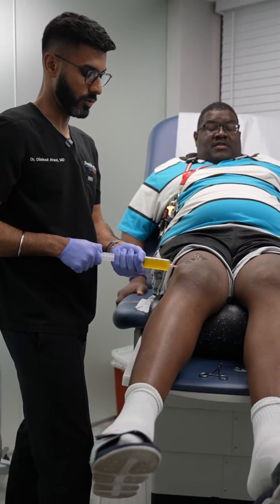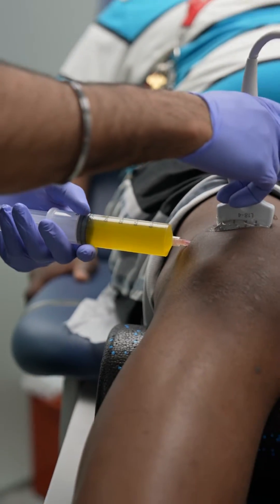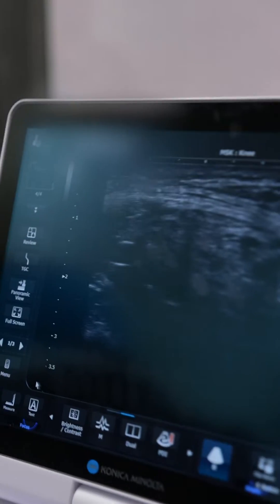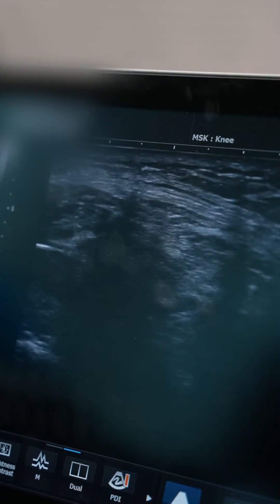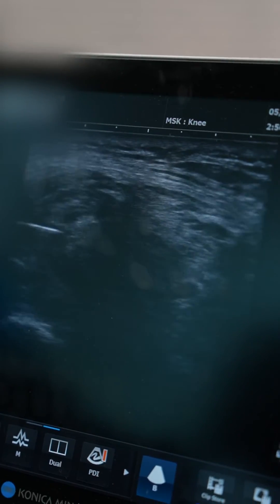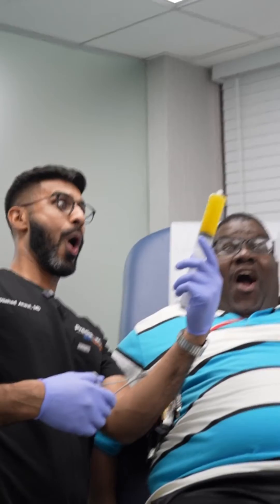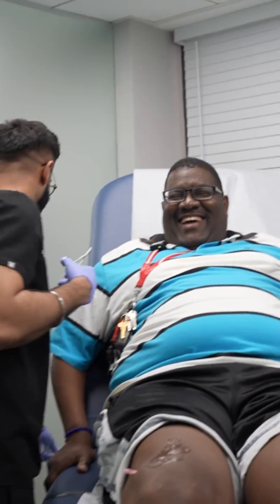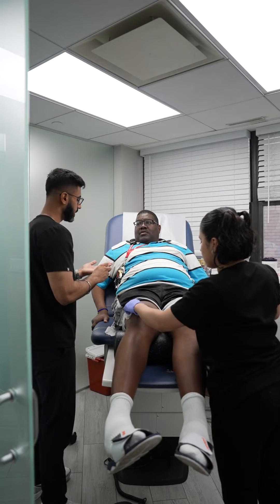Was the left knee hurting you more? Oh yes. There was more fluid in the left — oh my god, I can't believe this. You see that's it, because the rest is the tip of the needle. I can see the needle — that's the tip, and now that's just all the muscle around it. So it looks like all the black is pretty much gone.